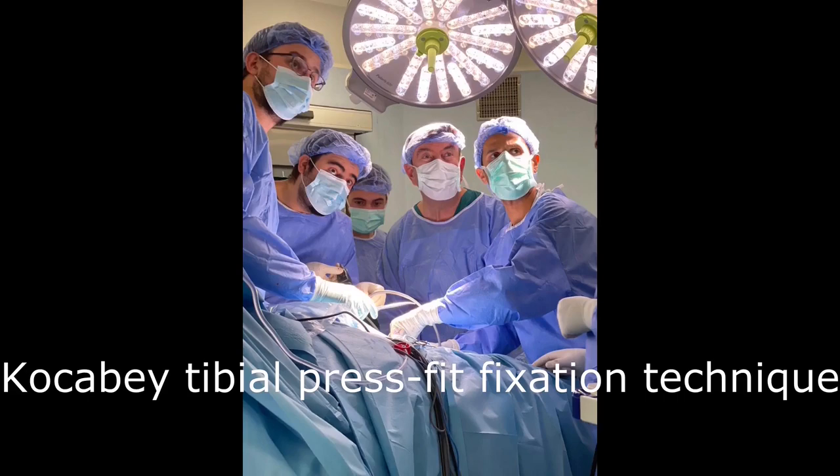In this video, I will describe a tibial tunnel preparation method and the use of patellar tendon tibial bone graft in the implant-free tibial press-fit technique.